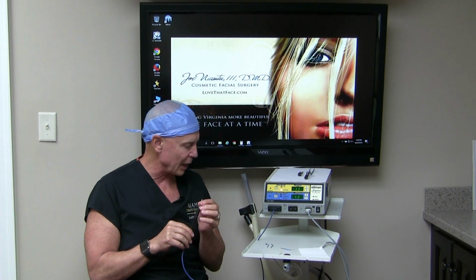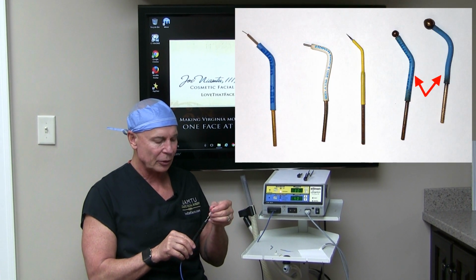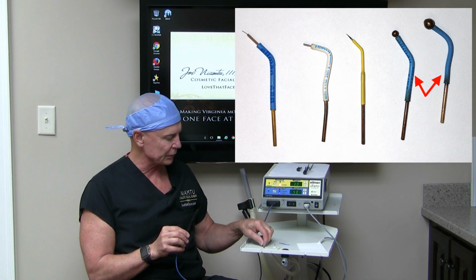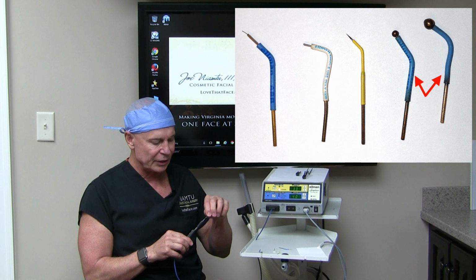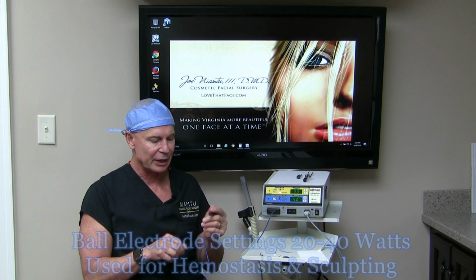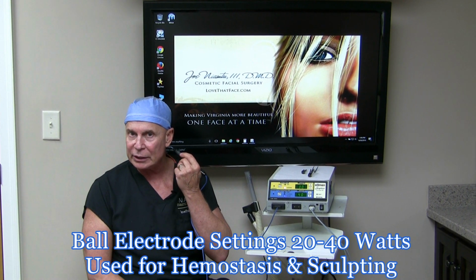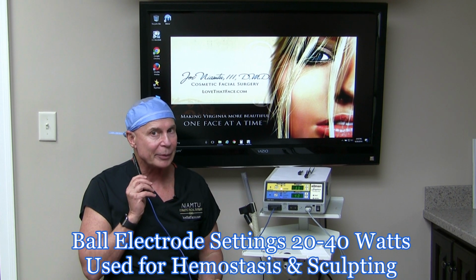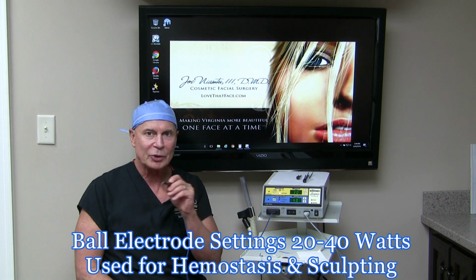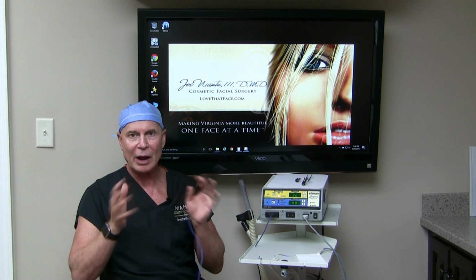So that's very ergonomic. Finally, in terms of electrodes, we have our ball electrodes, and there are different sizes, small balls and large balls. You can use these to burn off lesions like DPNs or moles instead of the pin type electrode. I use this a lot when I'm doing ear surgery to reduce prominent areas like a pointed lobe. Anytime you're sculpting or melting, I use this, and for rhinophyma as well, although Ellman has rhinophyma electrodes.